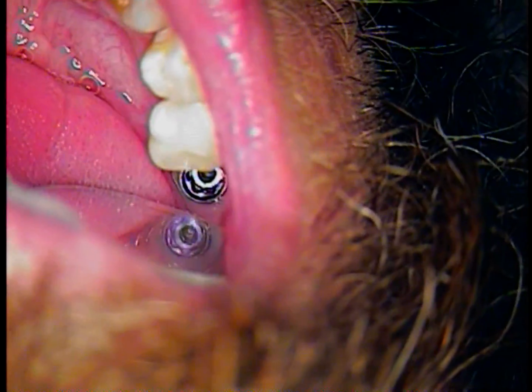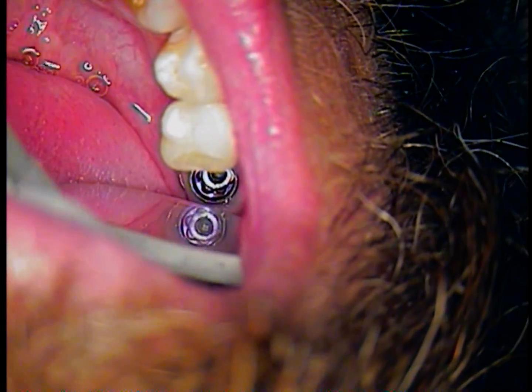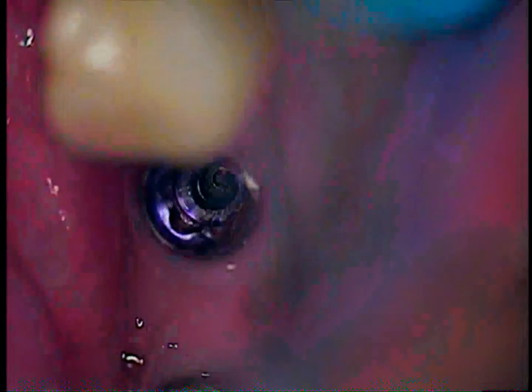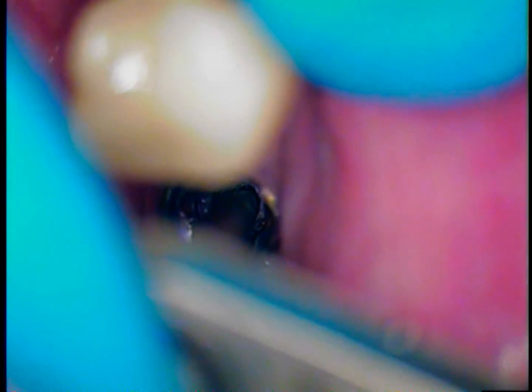One of the instruments that was used, the metal was just a little too soft. So what you'll see right now is the slot itself, and now we're putting in and measuring a flat driver from another implant company. And we'll try to customize the tip of the driver itself.